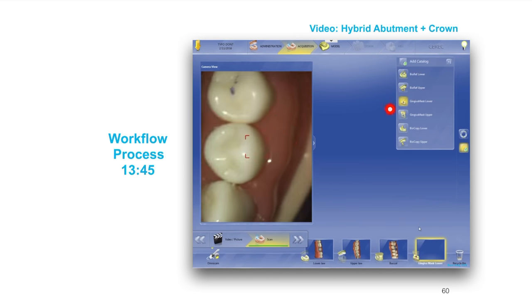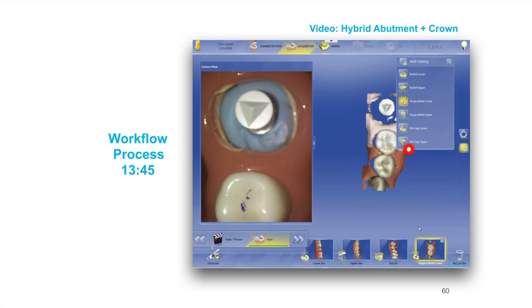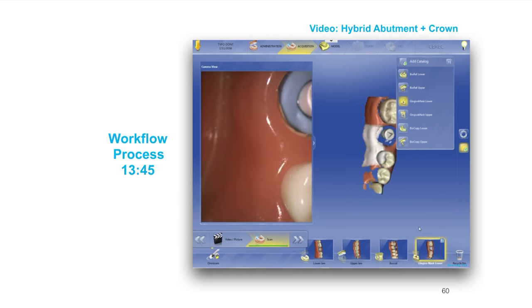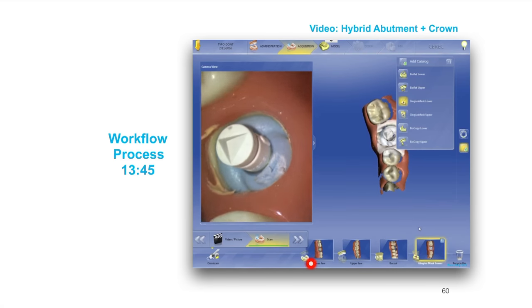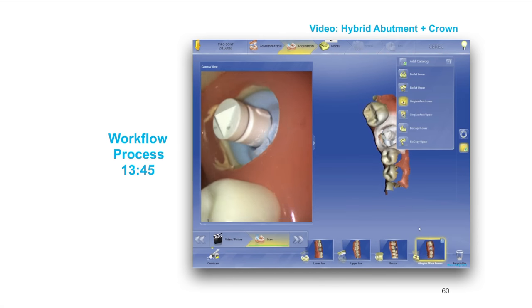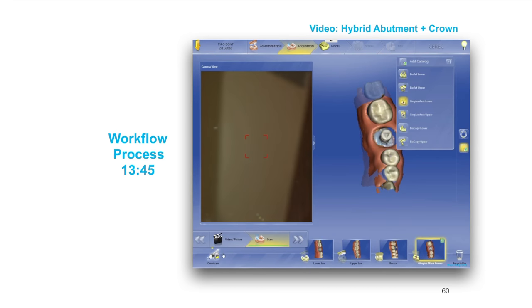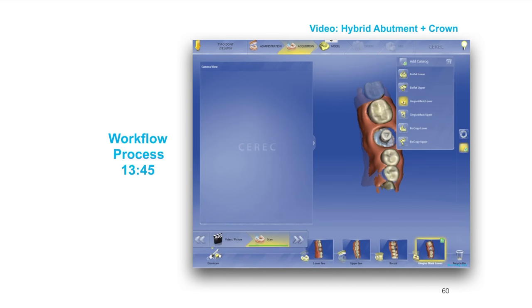Now you'll notice how I added this gingival mask — I went over here to add and added the gingival mask, and I'm re-scanning over here. You don't necessarily have to. I could have just taken this one, dragged it over there, and hit copy. A lot of people when they're doing the gingival mask will actually take the tie base out, and there's a reason for that — we'll get to that in a second.